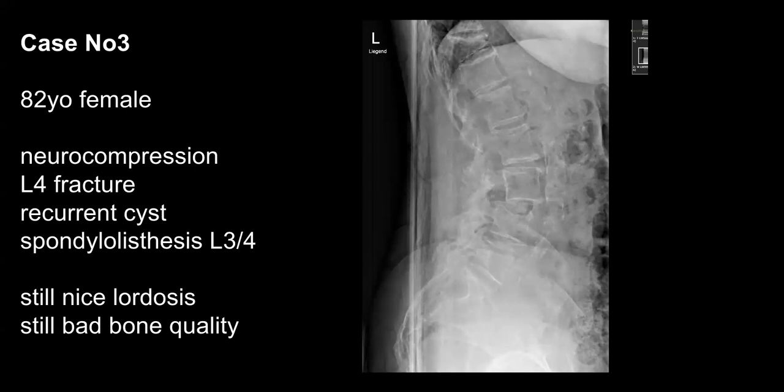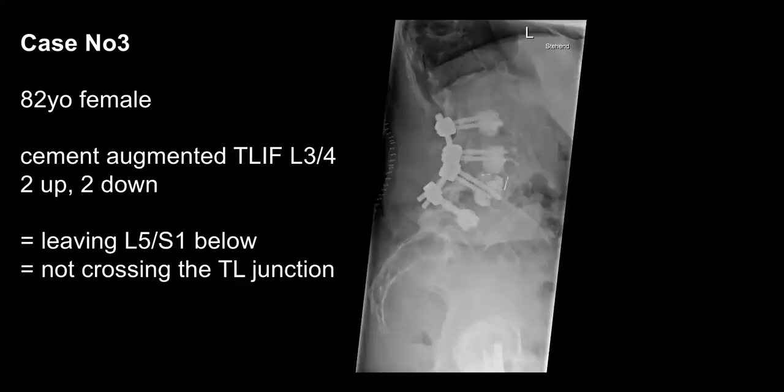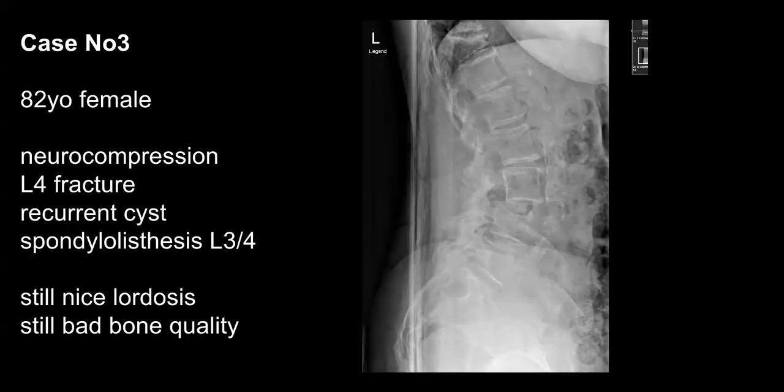You're not familiar with German, but this L above here on the X-ray, and this here, oh, sorry. No, I ruined it. And this here is a fracture. Here we have the L4 fracture, and here it says lying. So the patient couldn't get up. She was not able to walk. Andrew or Mike, are you able to jump in and ask what you would have done in this situation?